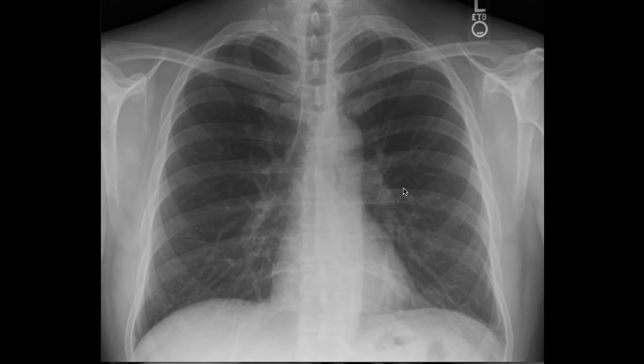We have a couple or a group of conditions that are pneumonia, lobar collapse, we have pulmonary edema, symptomatic pneumothorax. Now this is a very crucial point since pneumothorax is an emergency pathology and we have to deal with it within a time frame. So acquiring a chest X-ray is really critical in this phase. You have tension pneumothorax, and that's the advanced form of pneumothorax. You have pleural effusion, and that's the deposition of fluid within the pleural cavity, and it has a very special appearance on a chest X-ray.